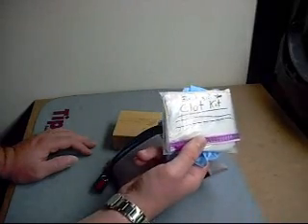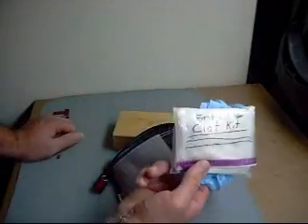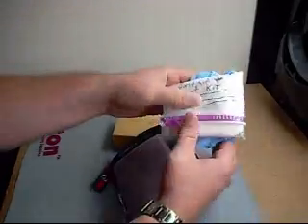Okay, I know there's Quick Clot out there and better rubber gloves and everything else, but this is better than nothing. And I have the gloves just folded in this. That way if somebody's bleeding, you reach in there, you grab this, you have it.